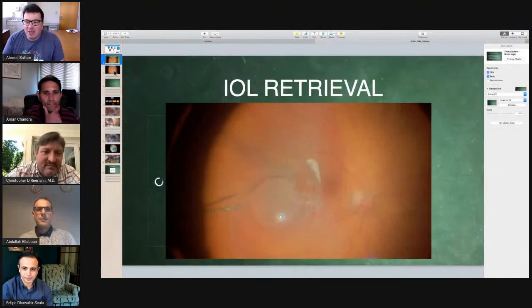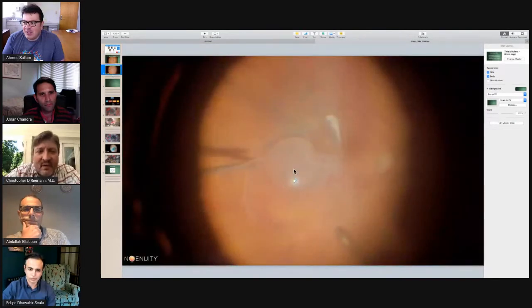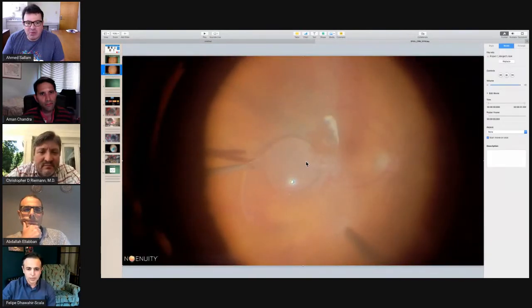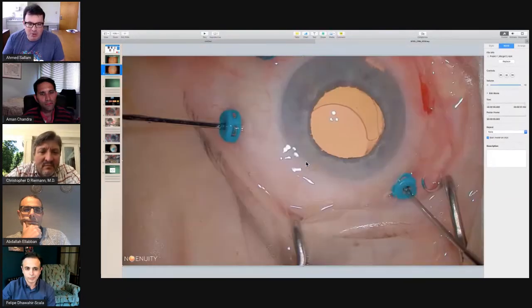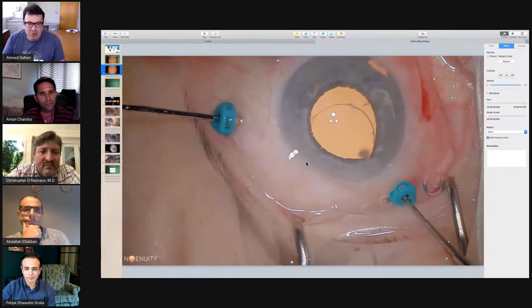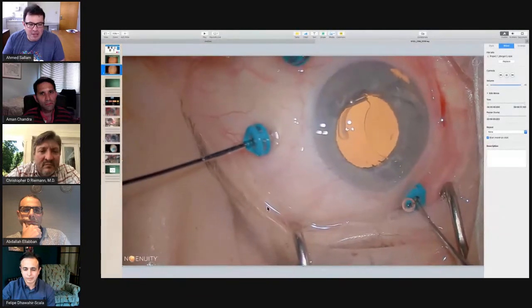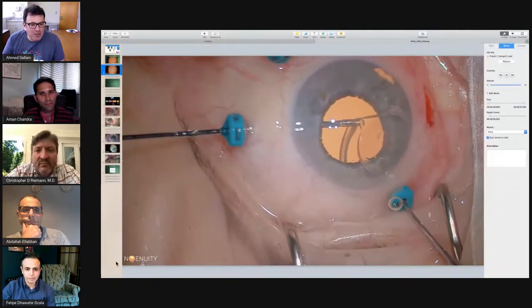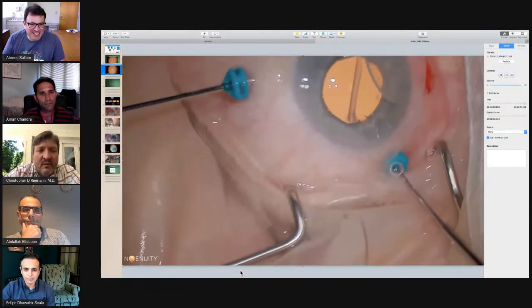First thing about the discussion is more about aphakia and dropped IOL. So I'd like to kickstart by discussing surgery for removing dropped IOL. We'll start with Christopher here. This is the classic technique where we go with the forceps, pick it up, bring it into the anterior chamber, and then retrieve it from there. Chris, if you can show us your technique for doing this.